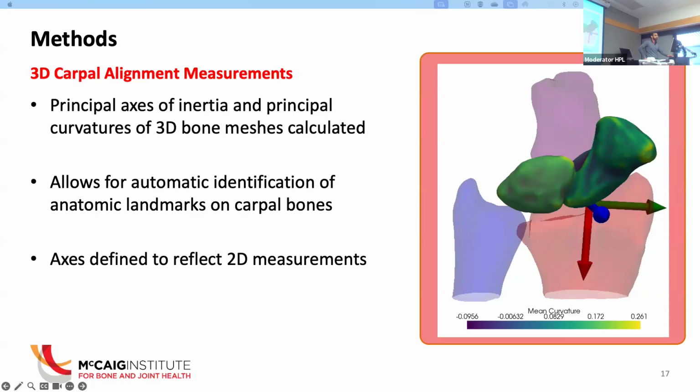I know you've been asked this question before, but I forget your answer. Do you think people are loading one hand more than the other for injured? I'd say for the injured, there probably is a bit of difference. So moving forward, a future direction of this project would definitely be to incorporate a force plate or something, just to see if there's consistency across both hands in where they're applying their loads, whether that be on the palm of their hand or more towards their fingers. I think that'd be a really interesting thing to look at moving forward for sure.